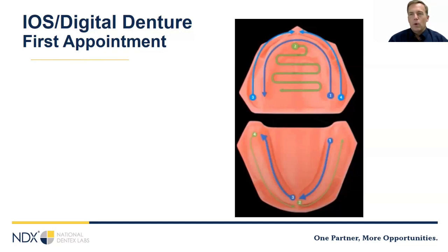As you know, there's a lot of mobile tissue, and so you have to get the patient open enough so that you can scan the tissue, but you also want the vestibular position and different things like that to be where it needs to be for accurate borders. I think most people are doing what we'll call a reference denture workflow that we'll talk about, which is a different kind of hybrid analog digital workflow. But if you want to do this procedure, you certainly can.